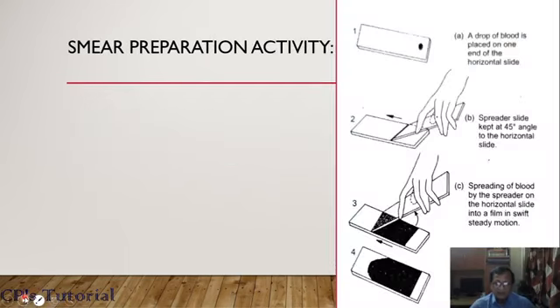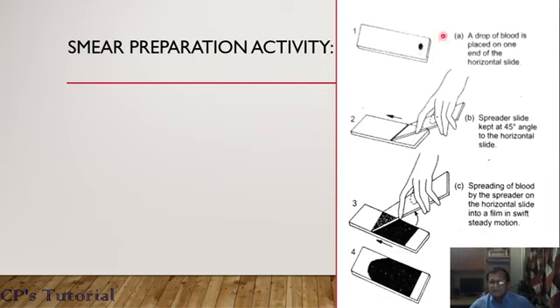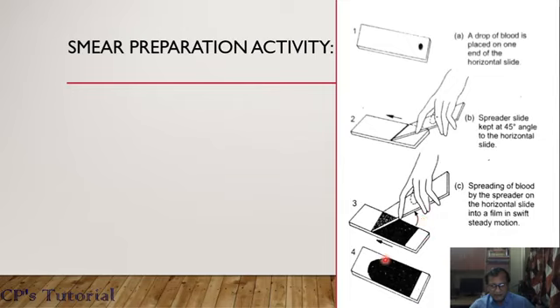For your visualization: this is the blood droplet, this is the attachment of the second slide with the droplet, and the blood has been dispersed sideways. This is the pushing of the blood forward at the angle of 45 degrees. This is the final vision of the smear, which is tongue-shaped. The dry smear is now ready.